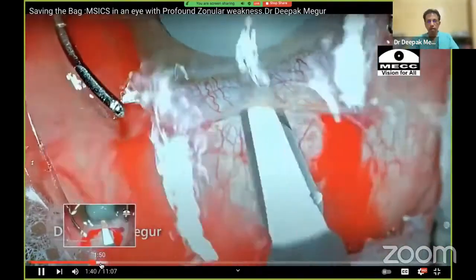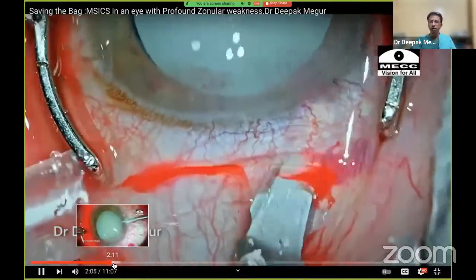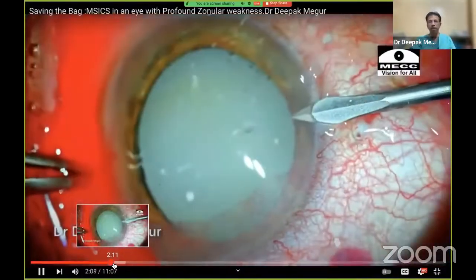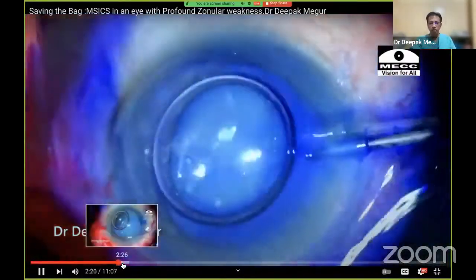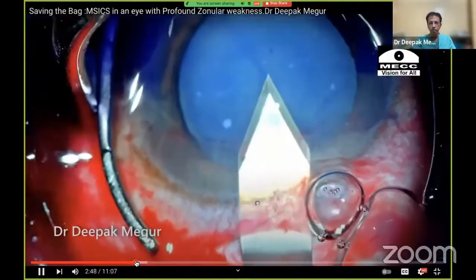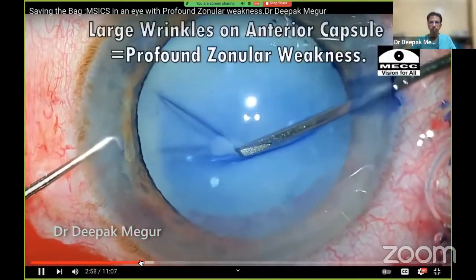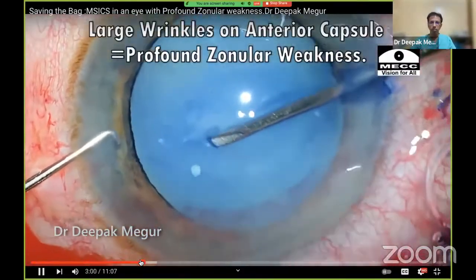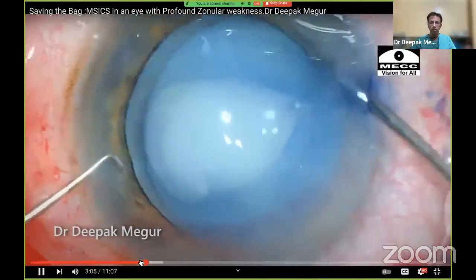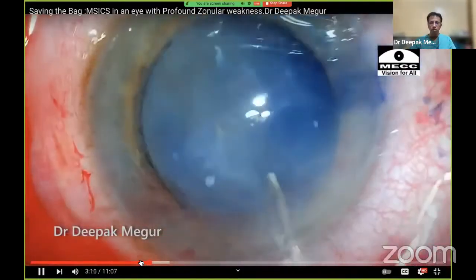We need some irrigation. This is a transconjunctival tunnel I'm making — no conjunctival flap. I'll tilt the OVD cannula a little so I can assess the zonules. We can see multiple folds in the anterior capsule, suggesting profound zonular weakness. Immediately, loose cortex comes out, so it's time to deal with it. I irrigate out the loose cortex to get good visualization and then plan accordingly.